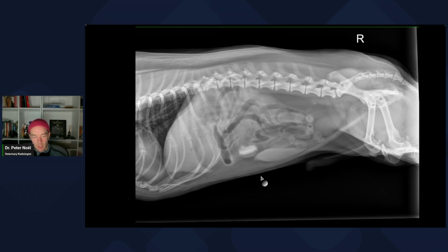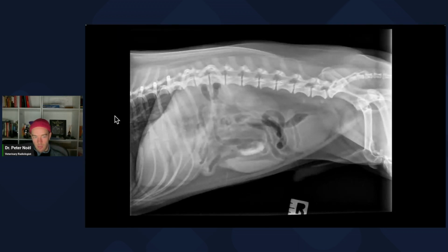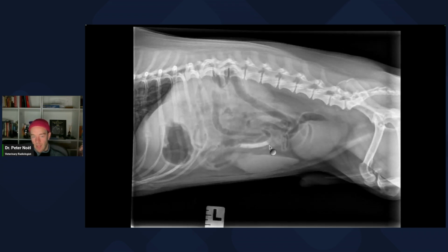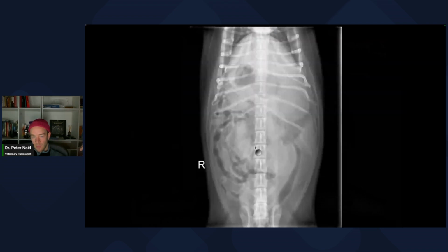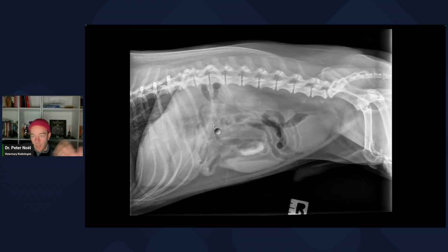If you wanted, you could do what this group did, which is hospitalize and repeat the study the following day. And what you'll find is that on this right lateral view, if the dog was appropriately fasted, this fluid is continuing to remain in the stomach, and the foreign body is continuing to remain in the small intestine. And it's right here to the right of midline. So here's the stomach right here, all the stomach. So you've got this persistent mid-cranial abdominal jejunal foreign body with persistent fluid-filled stomach. That tells me it's a proximal small intestine.